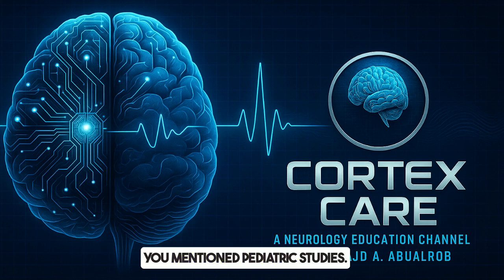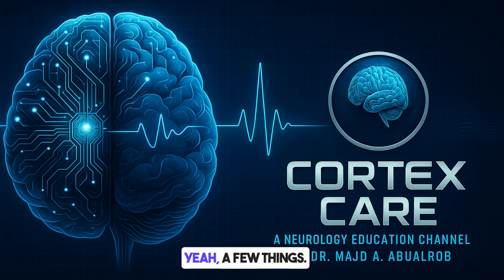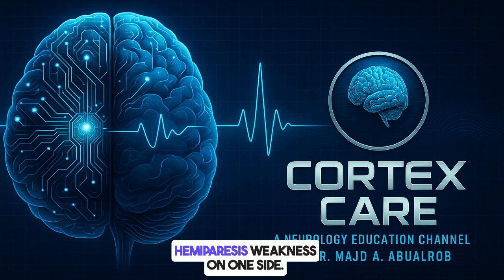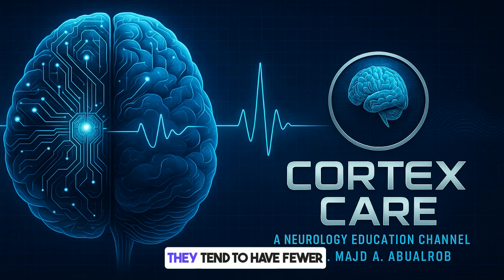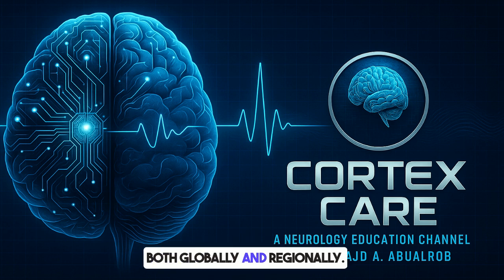You mentioned pediatric studies. Are there specific things to know about kids with NMDAR encephalitis in their MRIs? Yeah, a few things. Clinically, kids more often have movement disorders, cerebellar ataxia, coordination problems, or hemiparesis, weakness on one side. They tend to have fewer of the neuropsychiatric symptoms compared to adults. MRI abnormality frequency is about the same, 30 to 50%. But volumetric studies measuring brain region sizes have shown kids can have pretty substantial brain volume loss, both globally and regionally, and it can impair normal brain development.